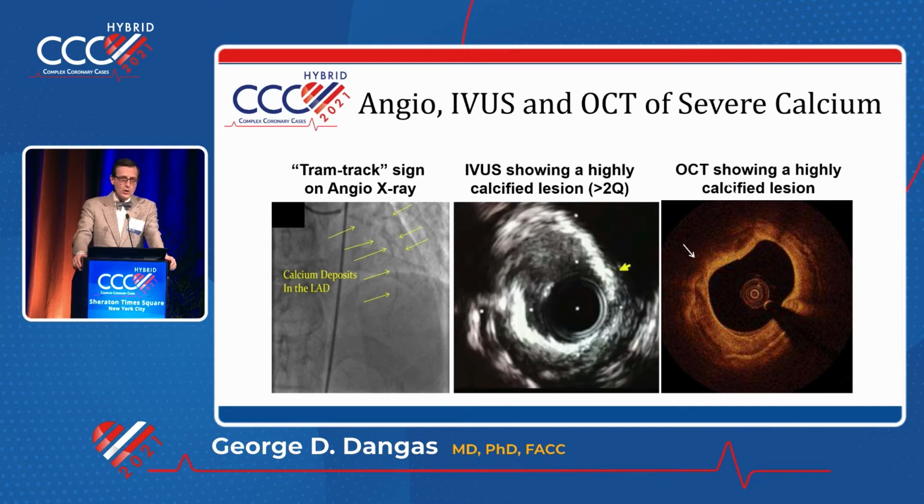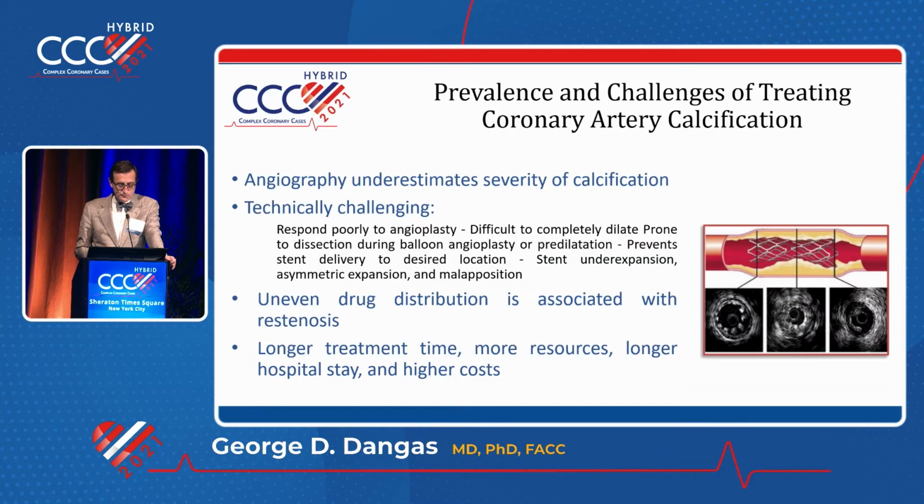In the center of this cross-section of the vessel, you can recognize a catheter. On the right side, you see very good imaging with the OCT, optical coherence tomography. Again, the catheter is in the middle. You see a tremendously clear interface between the lumen and the endothelium, and then you can see how a calcific plaque looks at the OCT. Obviously, you have to get accustomed to the black and white of the IVUS, which most of us are, I would say, and to the orangey tinges on the right side. And I think those are subject to change and improvement over time.